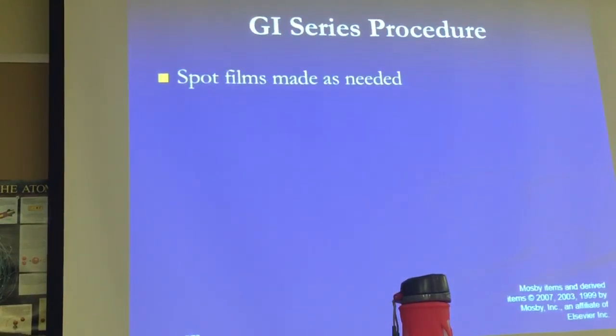If necessary, it will then fill the stomach, and at this point, if he or she feels it necessary, he or she will take pictures. These are called spot films. All right, let me explain. Not too many people do this anymore. Spot films refer to actual pictures.